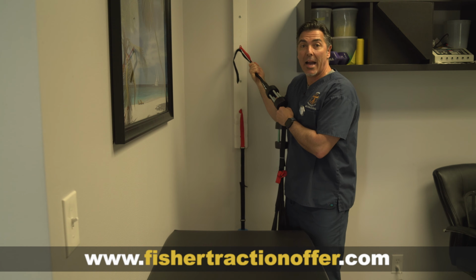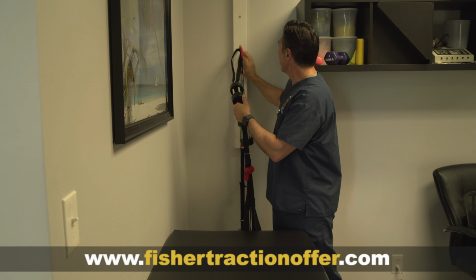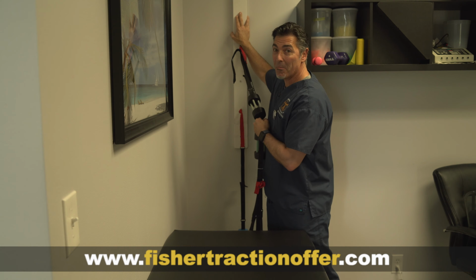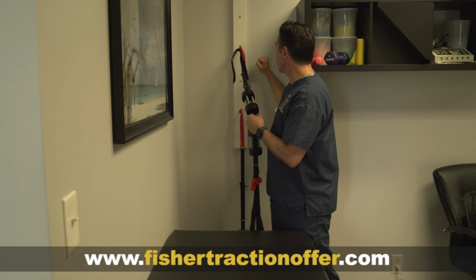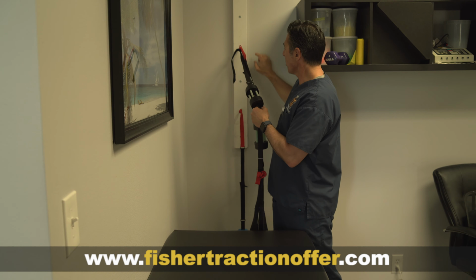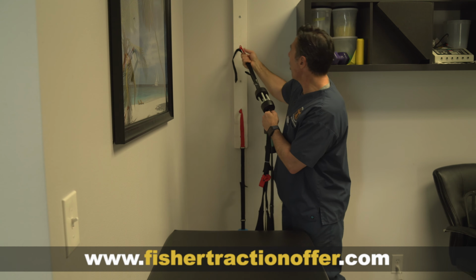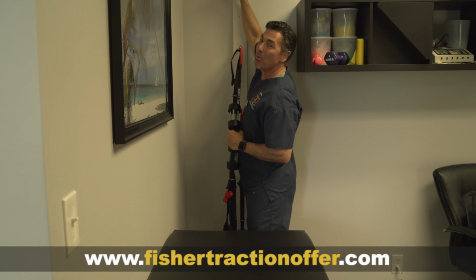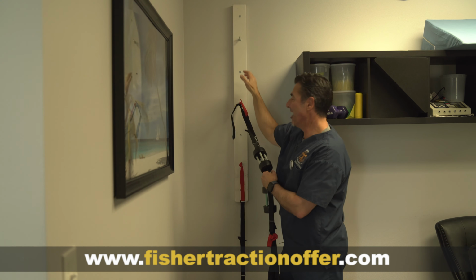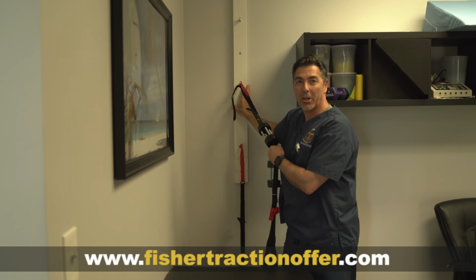So what I did was I created this, basically a 2x4, and I drilled holes in it and attached it to the drywall with molly-lag bolts behind it. So it's incredibly strong. I could, if I wanted to, put my body weight and hang on it, where there's no way this thing's coming off the wall where it could hurt anybody.